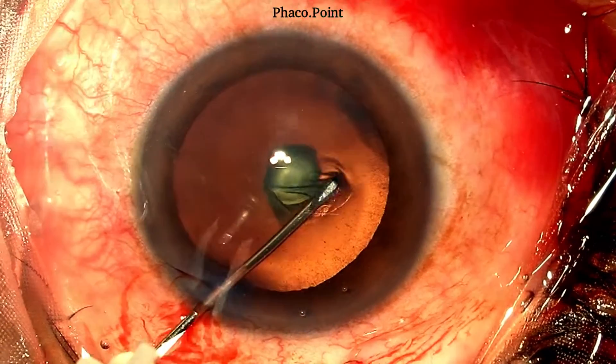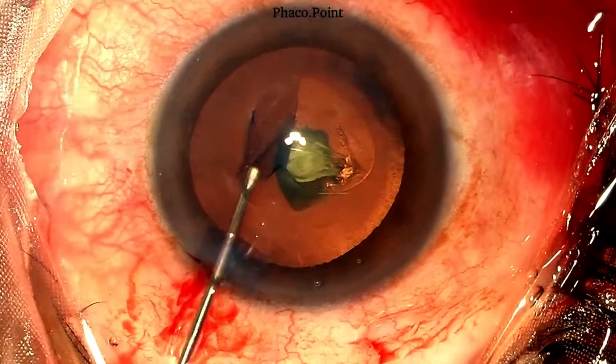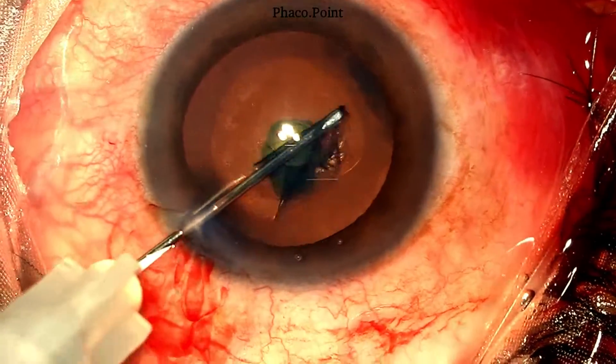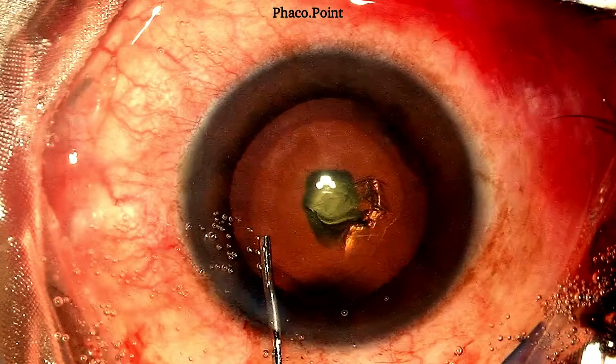Following the introduction of a viscoelastic to flatten the anterior capsule, a central 5.5 mm capsulorhexis is performed. It should be of this size because it allows for ease of removal of the nucleus as well as the placement of a 3-piece IOL should it be required.